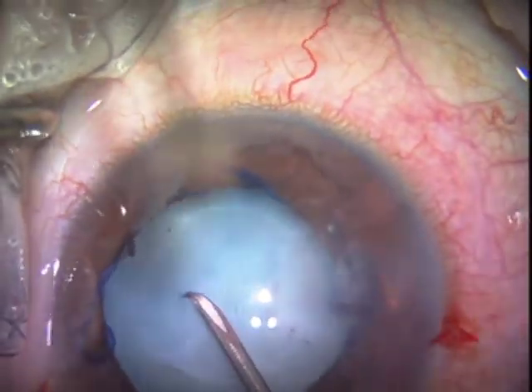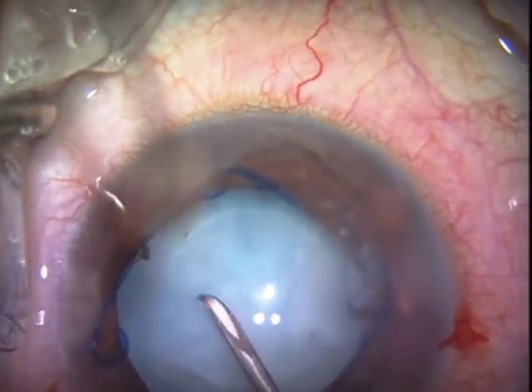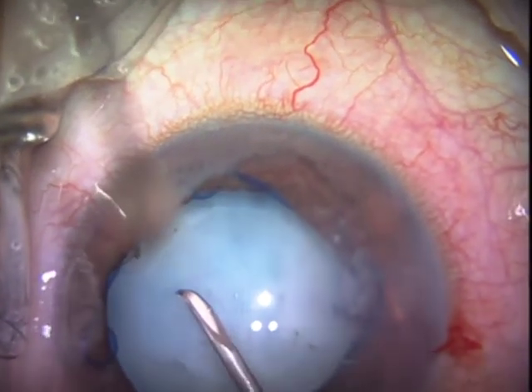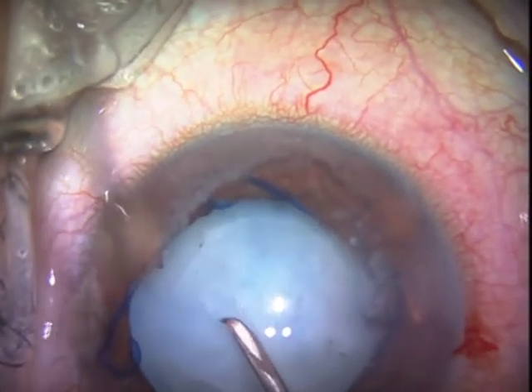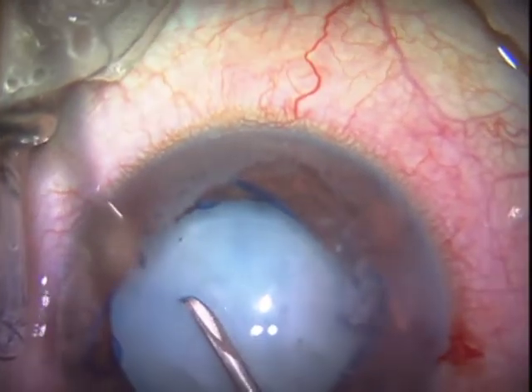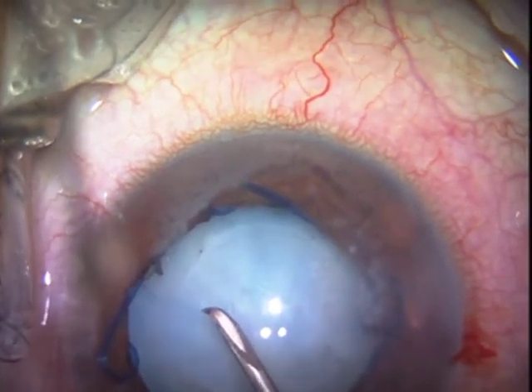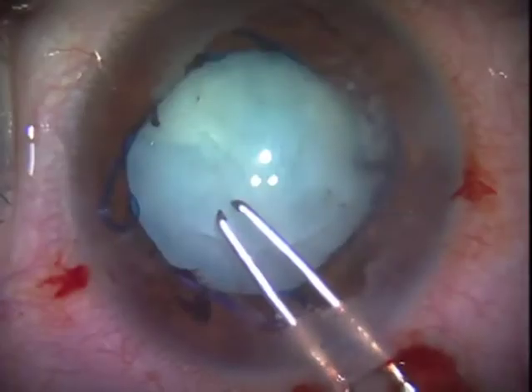Vision Blue has been used to stain the capsule, but it doesn't stain very well. I find that painting Vision Blue under viscoelastic and leaving it there for a while is more effective in staining than just filling the anterior chamber.